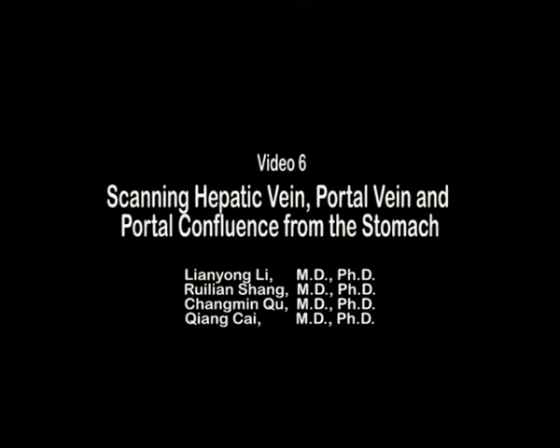Video 6. Scanning hepatic vein, portal vein, and portal confluence from the stomach. This video aimed to demonstrate how to image the hepatic veins, how to follow the intrahepatic portal vein to the portal hepatis, and how to image the portal confluence with the transducer positioned at the cardiac region of the stomach.